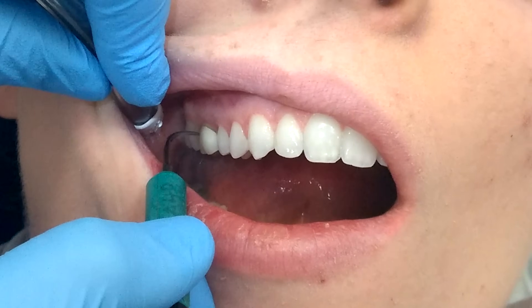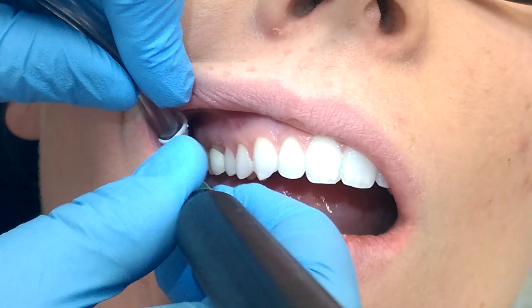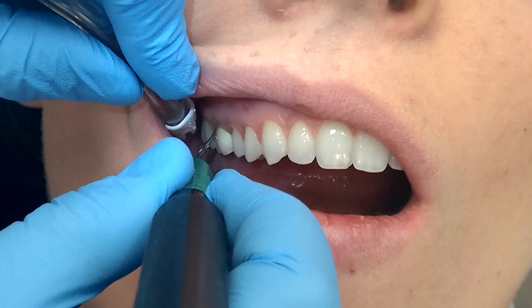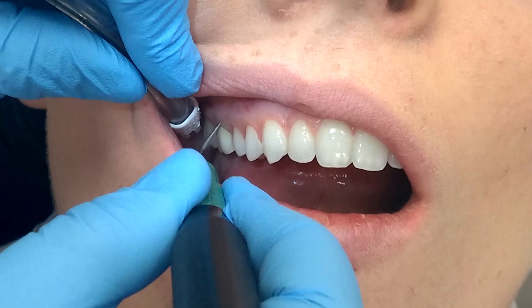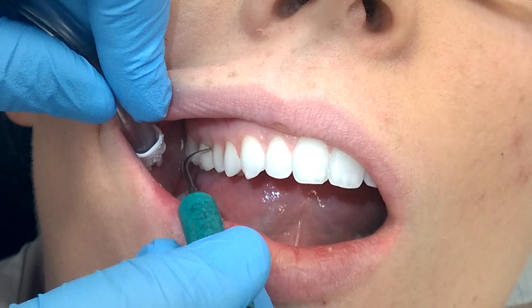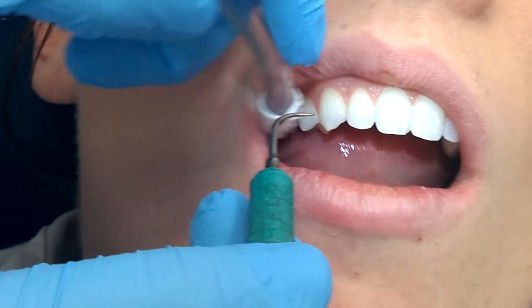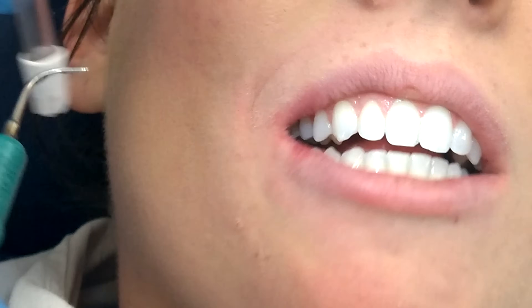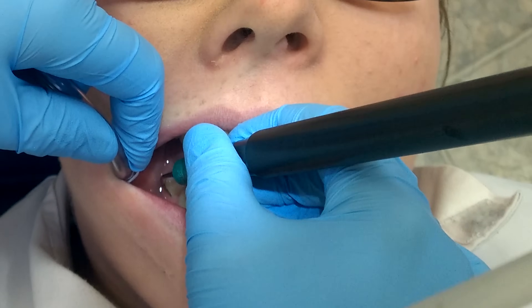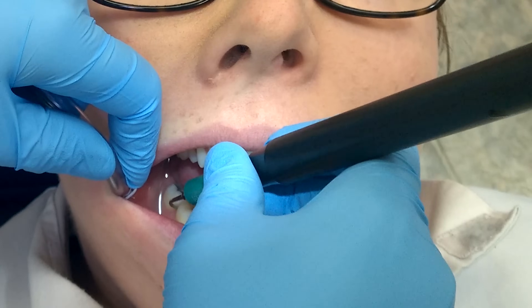As I go interproximal I use more of a curette style, and every once in a while I'll pop the suction back in to get some of the water out. Then I'll come in curette style again, then probe style more on the facials, rolling it into a curette style interproximal. On occasion you can let the patient close every two to three teeth to reduce movement when using the ultrasonic.